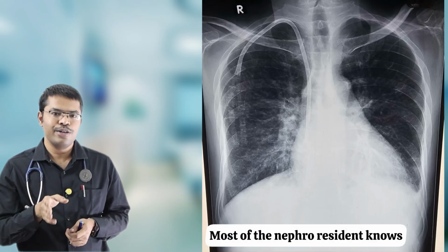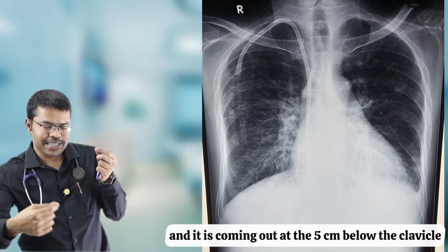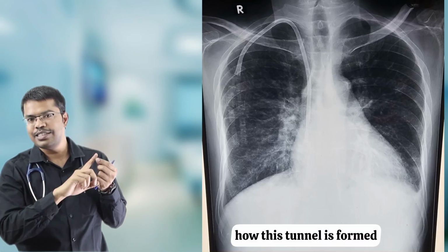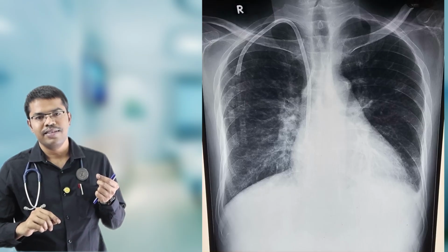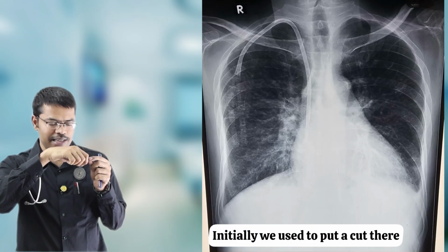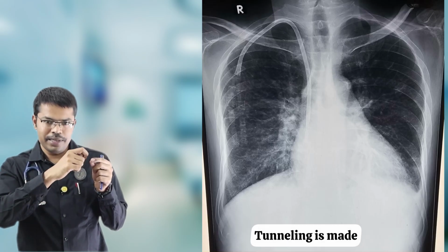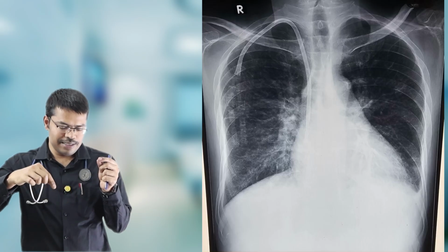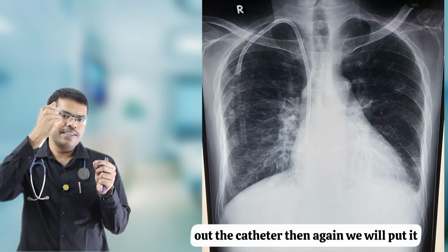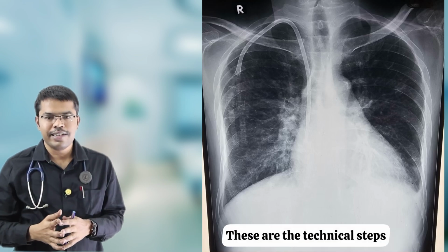Most of the nephro residents know how it is entering the vein above the clavicle and it is coming out 5 centimeter below the clavicle, how this tunnel is formed. See, initially we used to put a cut there where the guide wire is placed, tunneling is made, and the catheter is taken out from the entry site at the internal jugular vein. Then again we will put it. Finally we will suture it. These are the technical steps.